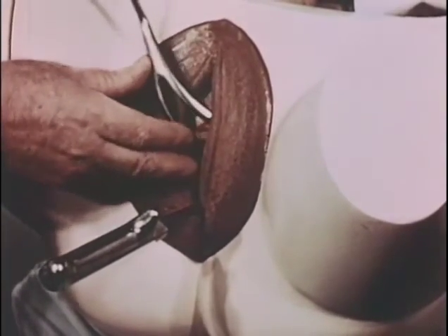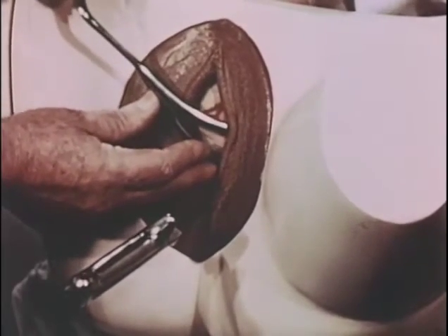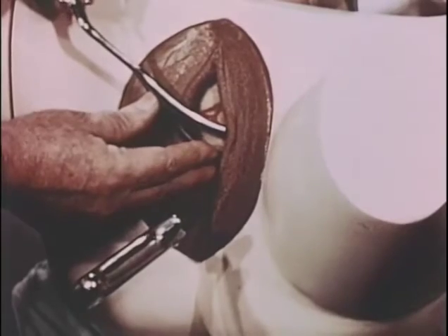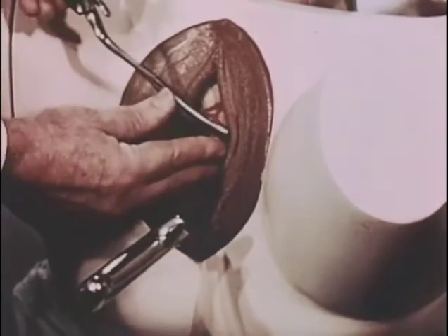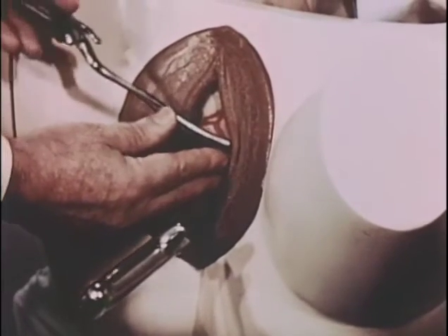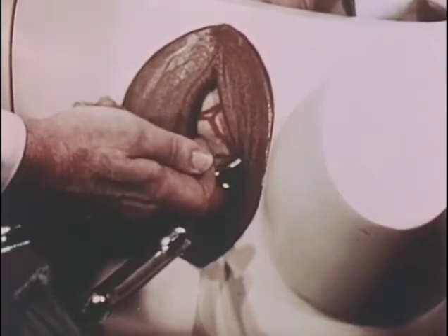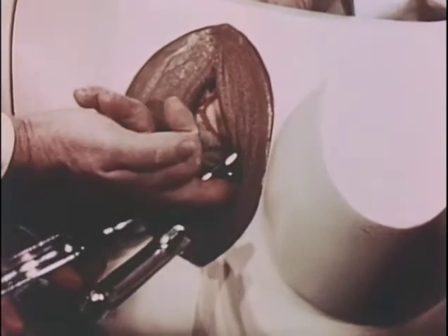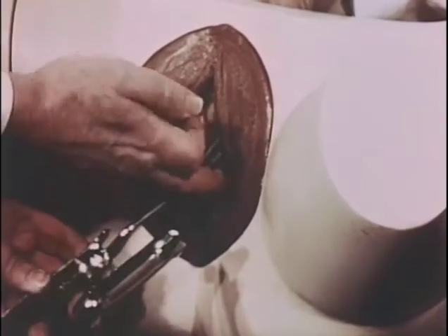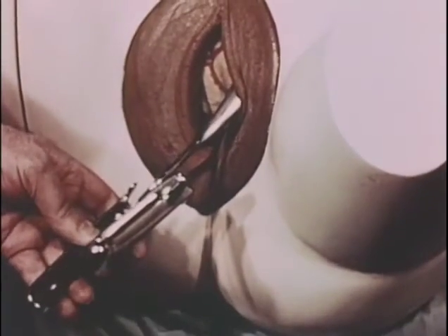And the toe is carried in at a little higher level than that of the posterior blade in order to avoid that posterior frontal eminence. And the hand shifts on the handle in depressing it so that the fingers can be put on the heel and lifting the blade around opposite the anterior cheek.